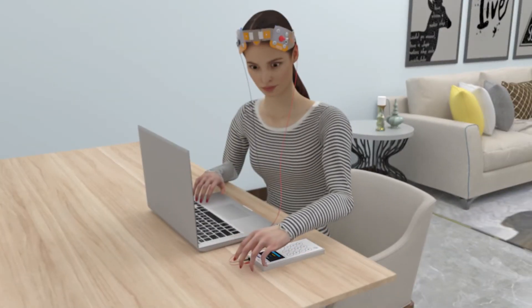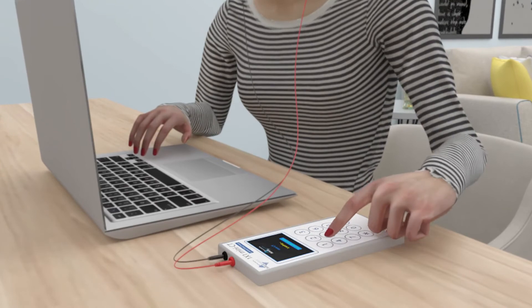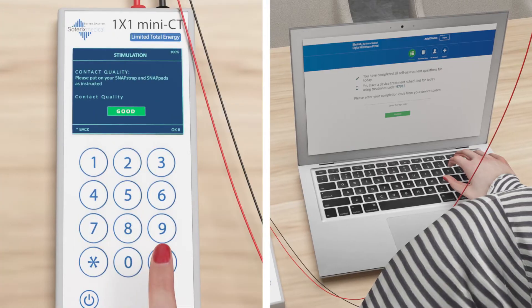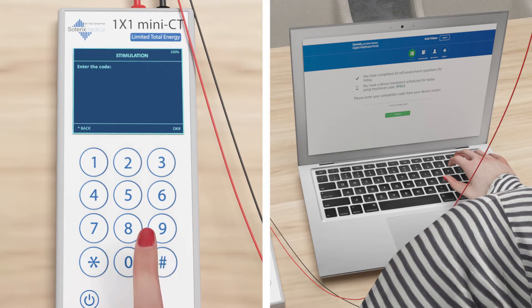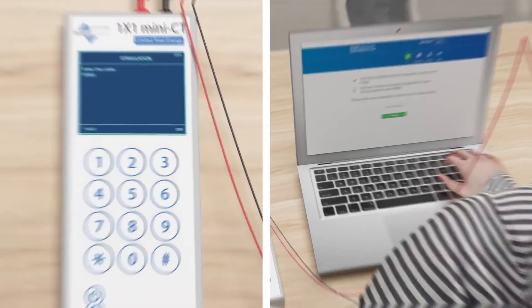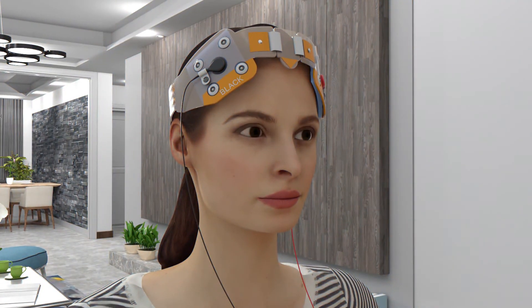Connect the mini-CT device to the SNAP strap cables and check for contact quality. Once the contact quality is good or moderate, start the stimulation by entering the dose code provided by the ElectraRx portal.